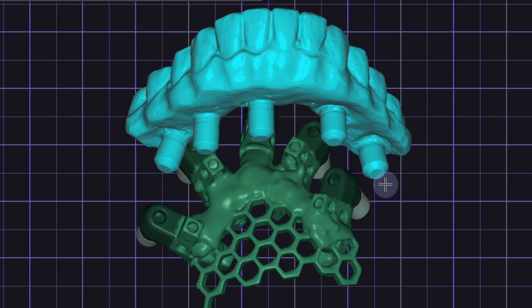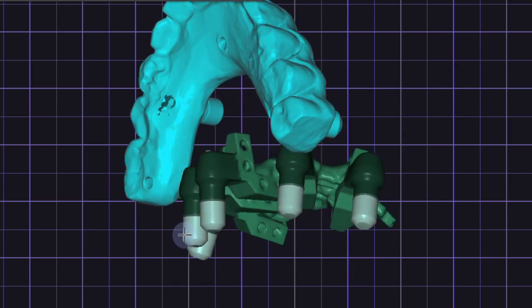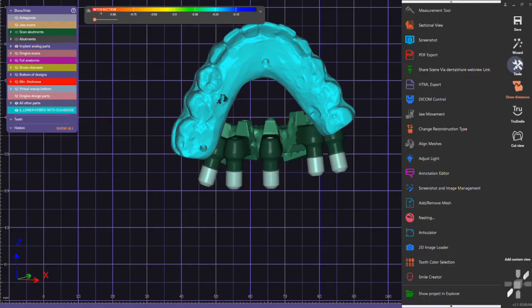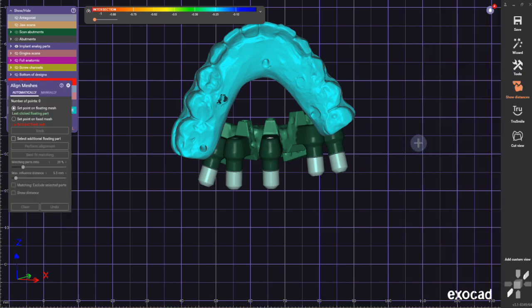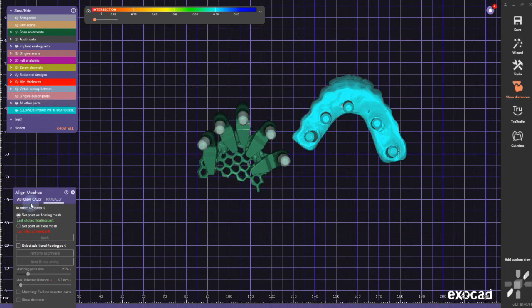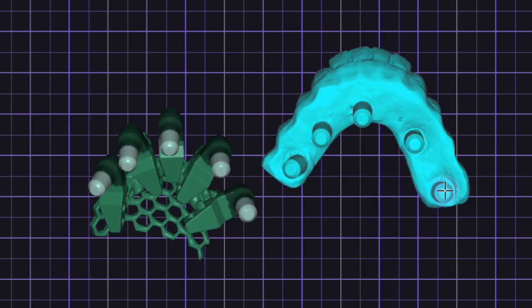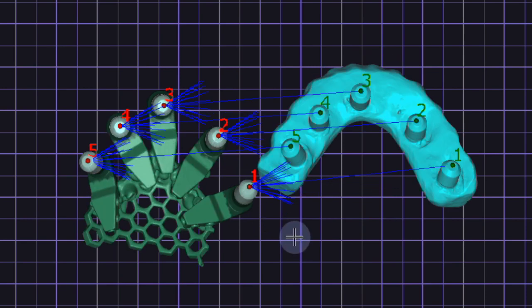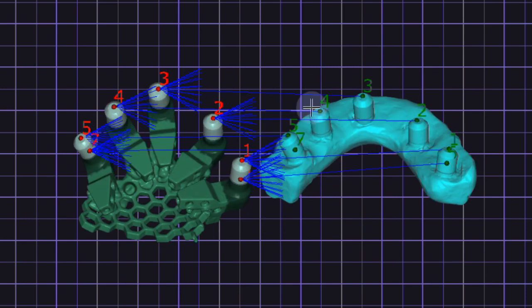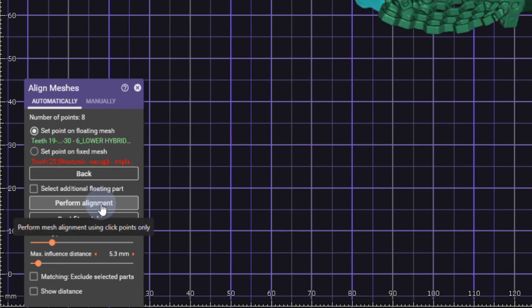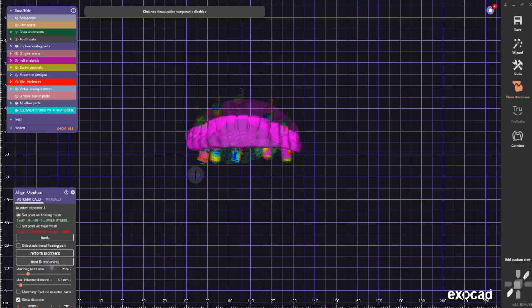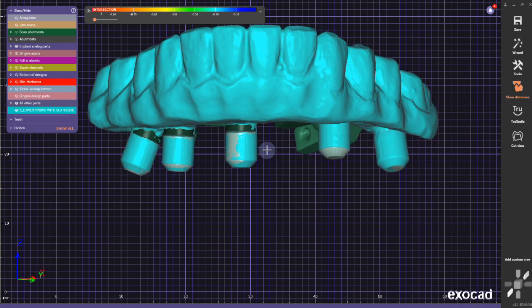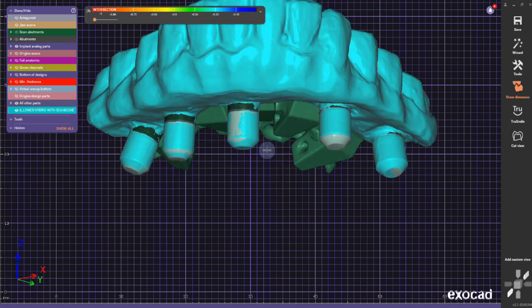It's really easy. Go to tools and to align meshes. Here I'm going to pick a couple of reference points. Usually the best option is to pick the scan flags. I'm going to pick a couple of points, perform alignment, best fit matching, and then you have your pre-op aligned to the entire situation.